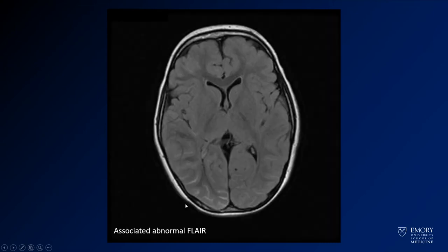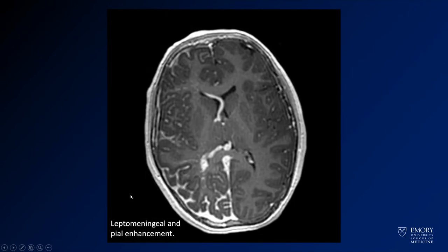Here on FLAIR, you get incomplete and complete FLAIR suppression in those areas. On post-contrast imaging, you get diffuse leptomeningeal and pial enhancement. You can also see the very prominent veins that drain centrally, because those cortical veins fail to develop.